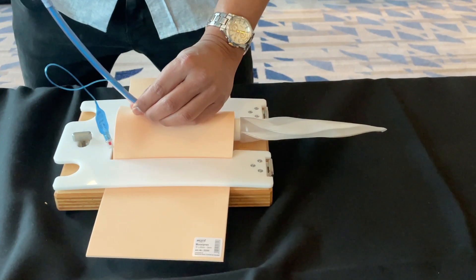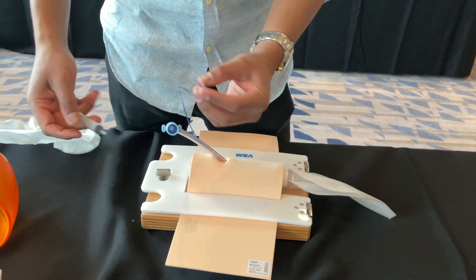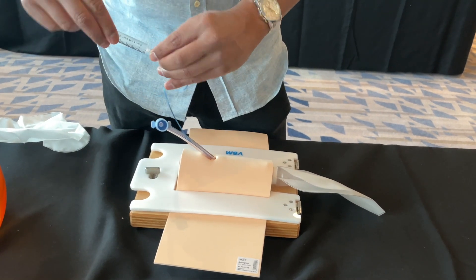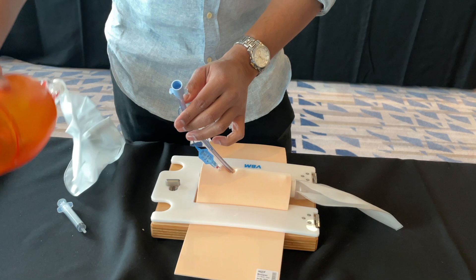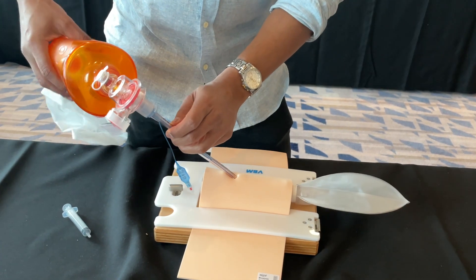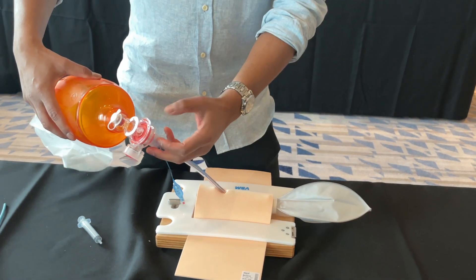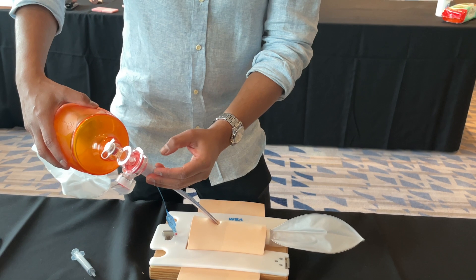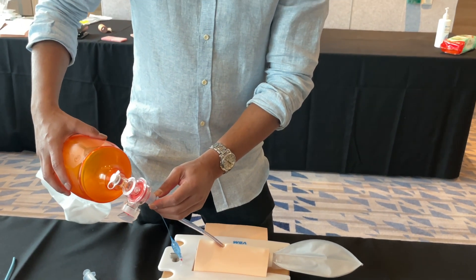I take the bougie out, then inflate the cuff — sometimes you may need more than five mils. I check there's no leak, then connect the Laerdal bag. You can see ventilation there. I can also attach my filter and end-tidal CO2 measurement device to confirm I'm actually ventilating the lungs.